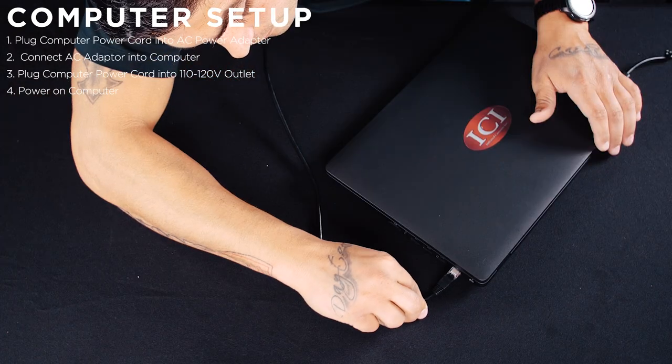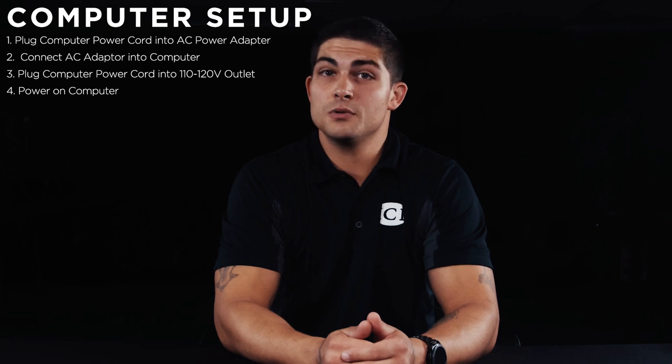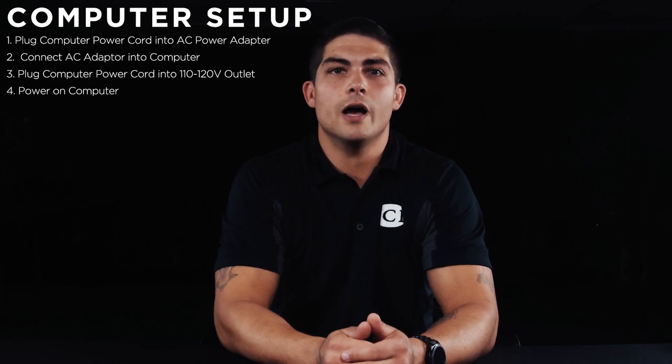Then connect the computer AC power adapter into the computer, and last plug the computer power cord into a surge-protected 110–120 volt outlet.